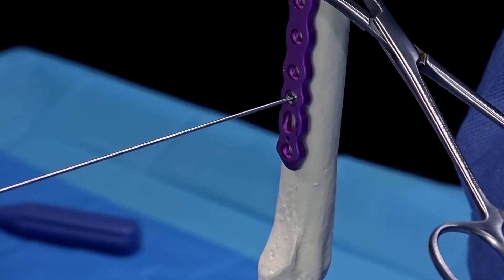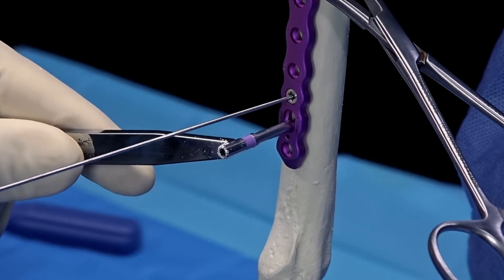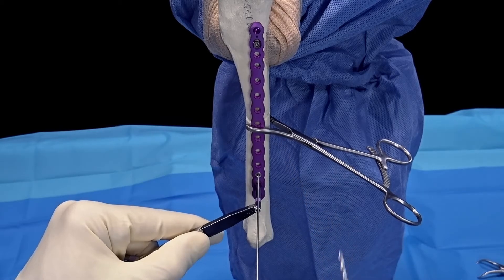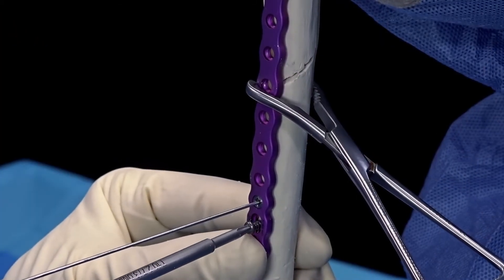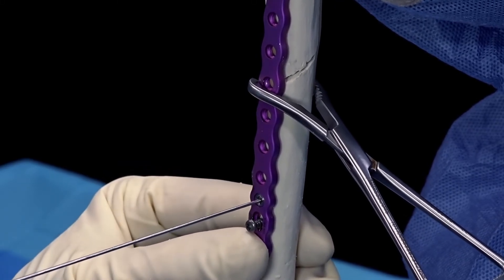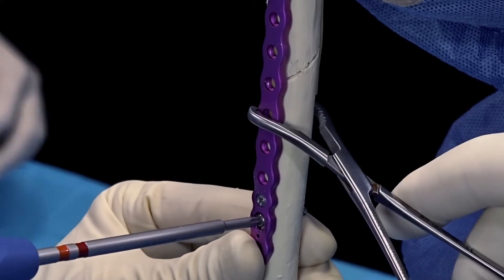The Arthrex compression hole provides a moderate amount of compression, so the surgeon should be familiar with this application prior to implant placement. In this case, we're going to place this in full compression — looking up towards the fracture site, we have a moderate gap. Prior to tightening our compression screw fully, we're going to remove the K-wire from the cannulated bending plug. As we tighten our compression screw, you can see that the fracture segment compresses, and we'll remove our lobster clamp.